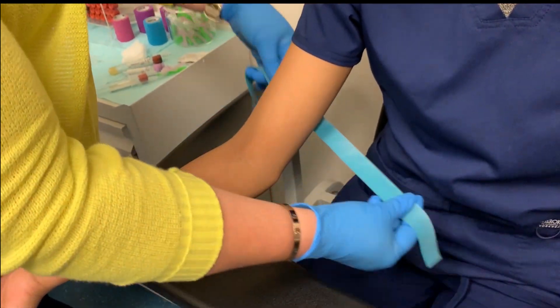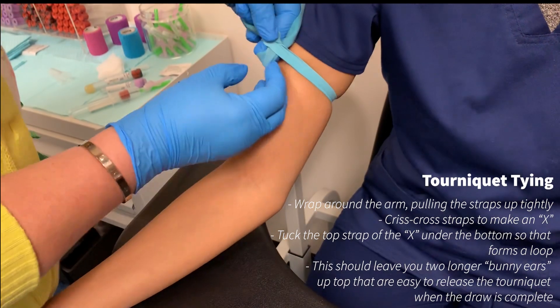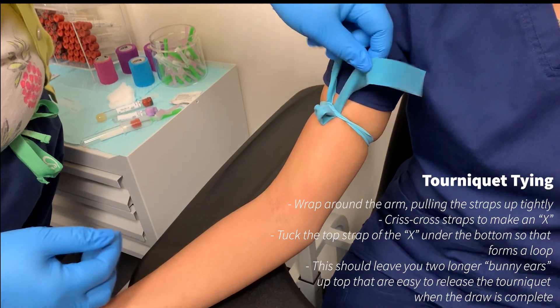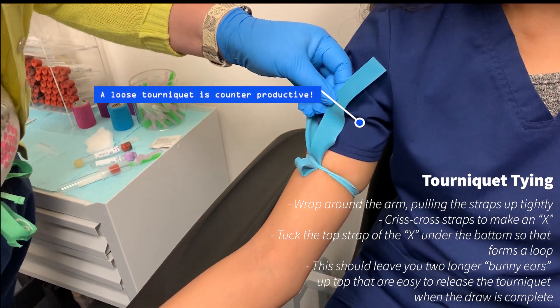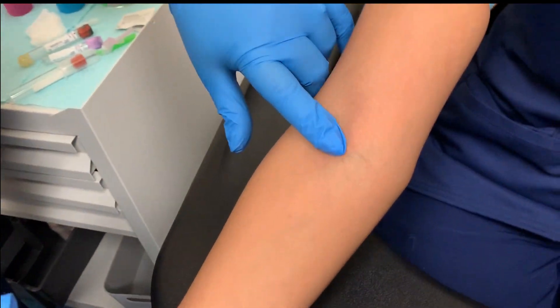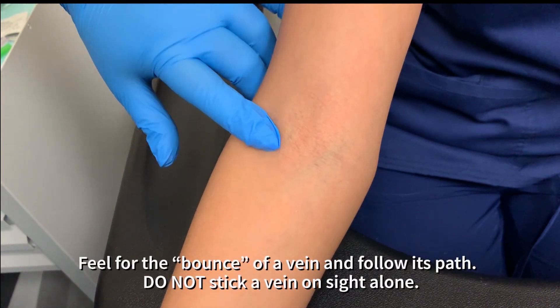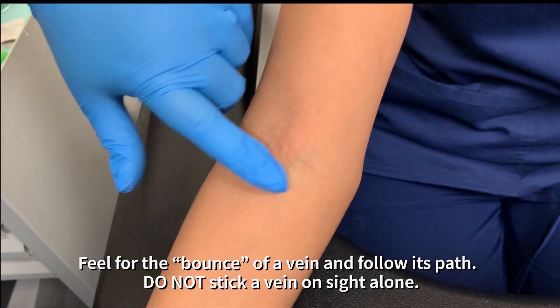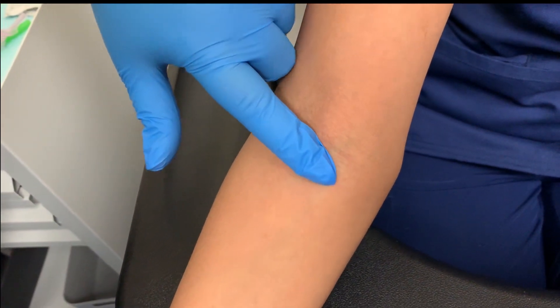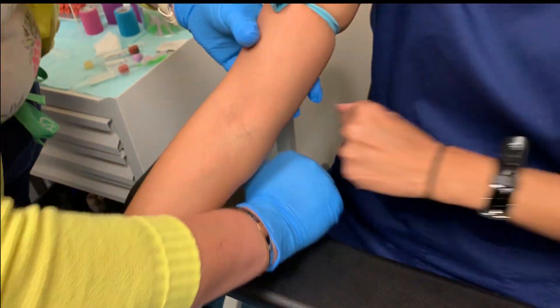I'm going to put the tourniquet on the patient's arm. You want to make sure that you leave your bunny ears up top and a loop at the bottom so that you'll be able to untie it one-handed. Then I'm going to feel where I want to draw. I kind of like this one right here — it feels really good, nice and plump underneath there.